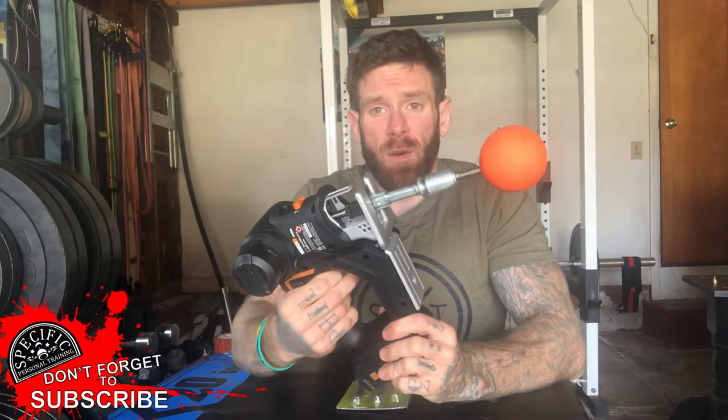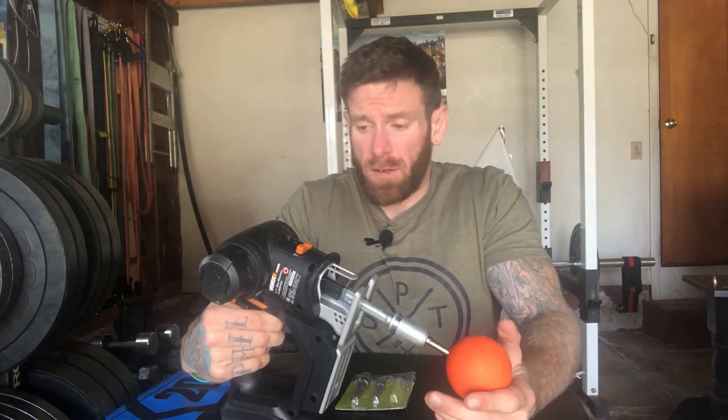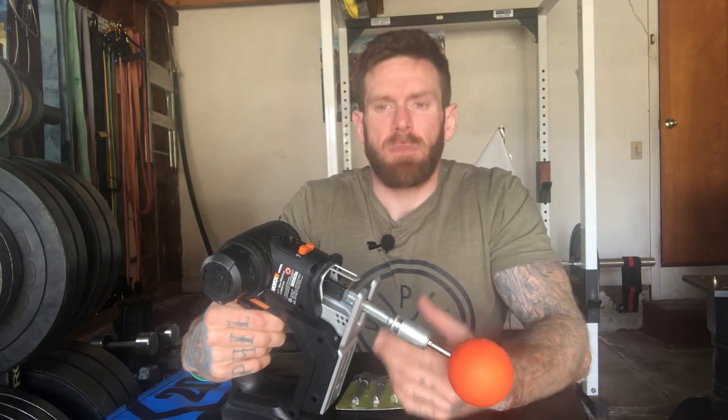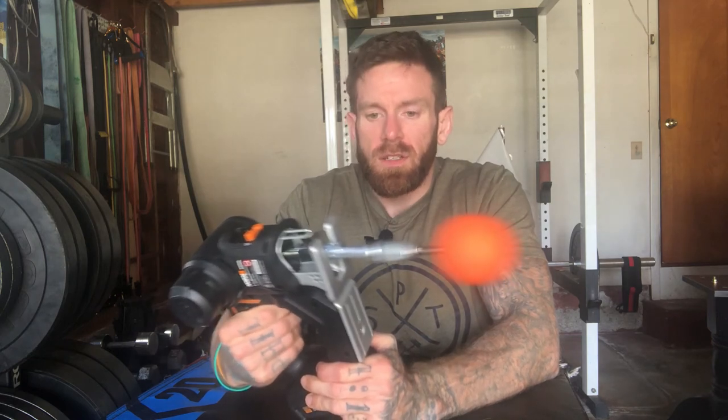And voila — there you go guys, there is your own DIY Theragun. Now the only disadvantage this might have compared to a traditional Theragun or any other fitness massage gun is that with this reciprocating saw it only really has one speed. You can kind of control the speed, but you have to have a steady trigger finger to do so.